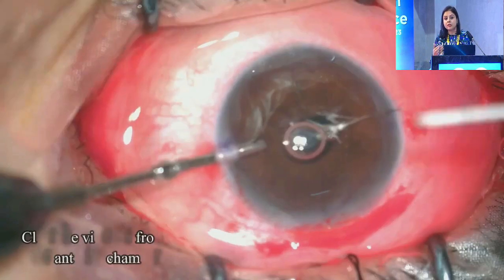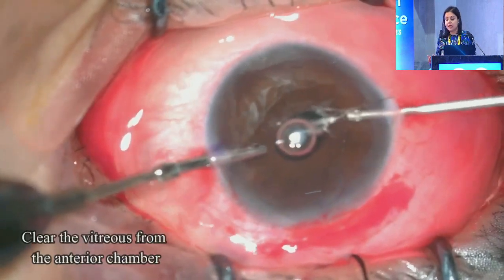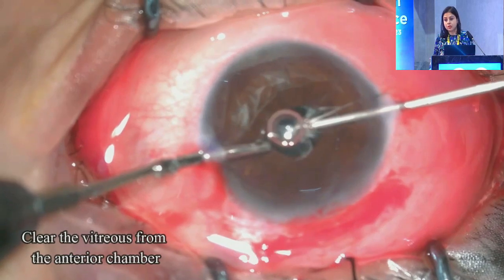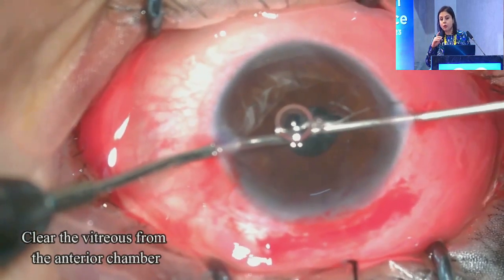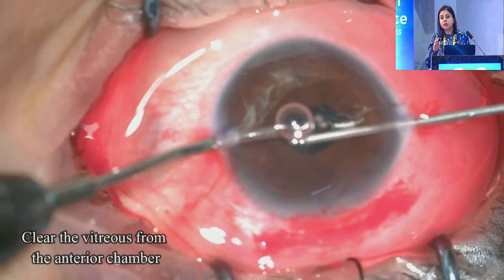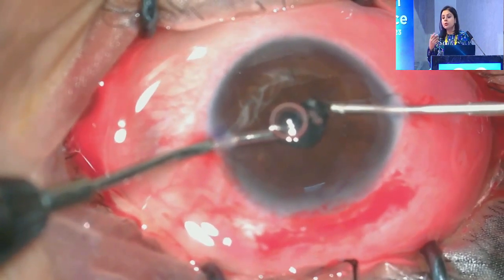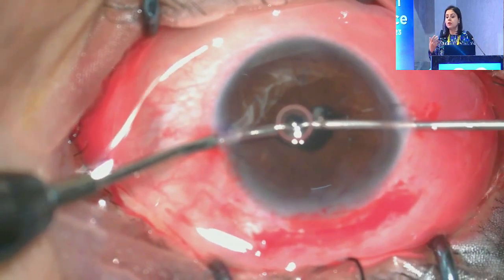If we enter at this point with the help of a keratome, we might have a lot of leak from the scleral incision. Then we go ahead with the vitrectomy cutter, and it is essential to make sure that we leave no vitreous in the anterior chamber. For a few cases, we might need to call in our retina colleagues, for patients who require a pars plana vitrectomy. Another important thing to remember here: if there are remnants of the capsular bag still remaining and we are going to implant this IOL, we should remove those also with the vitrectomy cutter, because they can get fibrosed over a period of time.